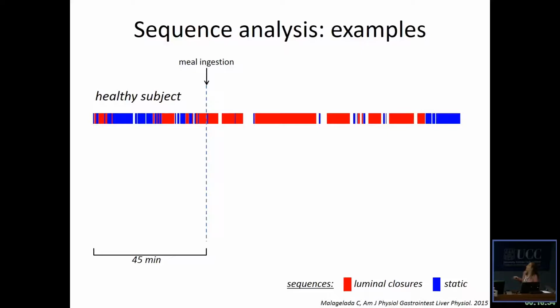So more recently, we applied a new kind of analysis to all these features. Previously we were detecting individual events throughout the video, but we thought it would be interesting to find periods where one of these events predominated or was in high frequency. So I'll walk you through this because it's not easy to understand.